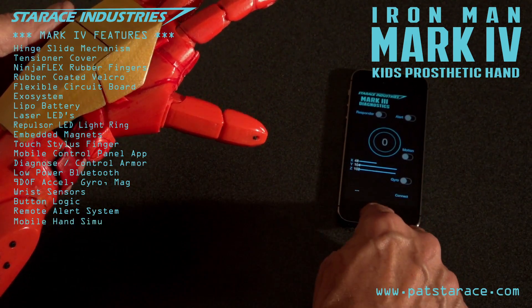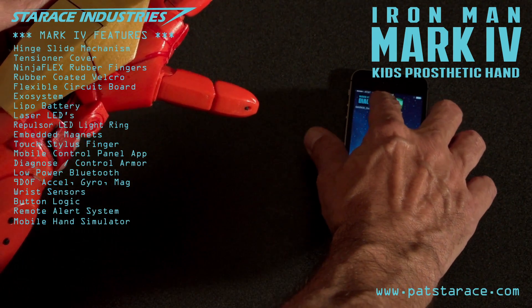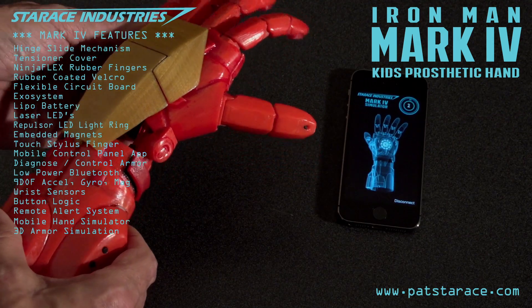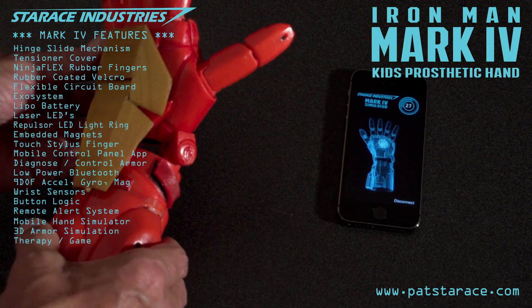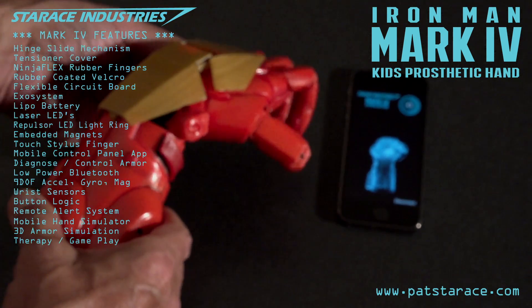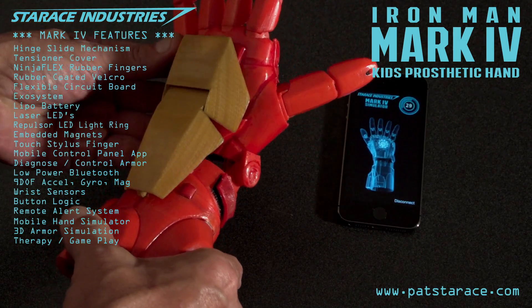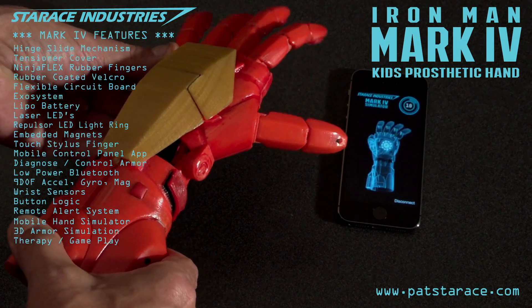Enable the mobile game simulator. Phase one of the app simulates the armor in 3D and replicates the movement of the hand. It can be used to develop muscle and extend range of motion. And it's quite fun. This is awesome. It's like having a game controller embedded in your hand. I feel the same way.